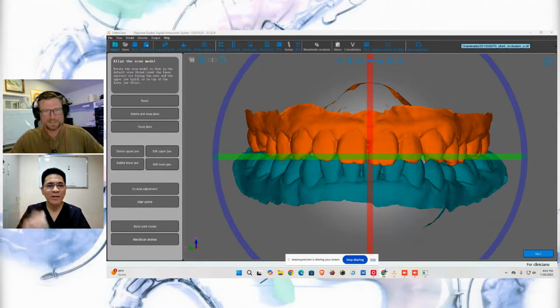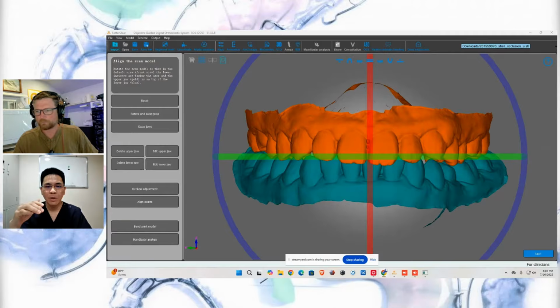Hello, everybody. I just introduced the pre-procedure because 25 years ago, when I was just beginning my master's degree of orthodontics, we were students, we needed to bend and make the retainer just ourselves. So I know the whole procedure, step by step. But now I know most of the labs use 3D printing, but they don't have the whole digital procedure for making the retainer.